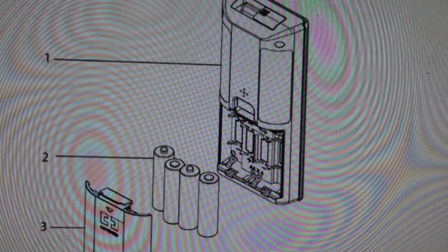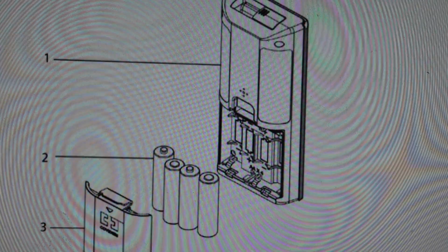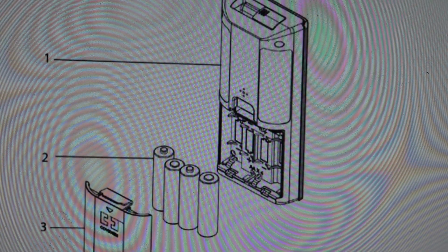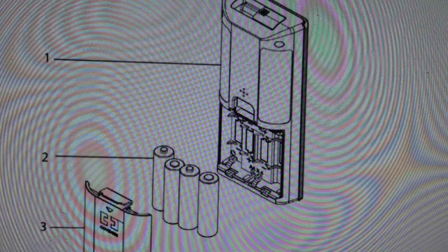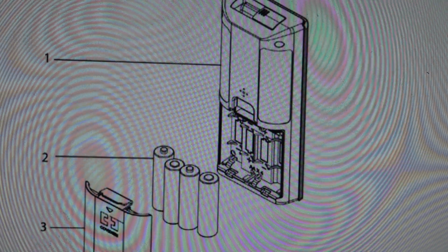Hey everybody, this is a real quick video in case you have a Covidien Nellcor PM10N patient monitoring system pulse oximeter and you need to change the batteries on it, either because you need to replace the batteries or because it's not working and you're trying to figure out why. It might just be that it needs fresh batteries.